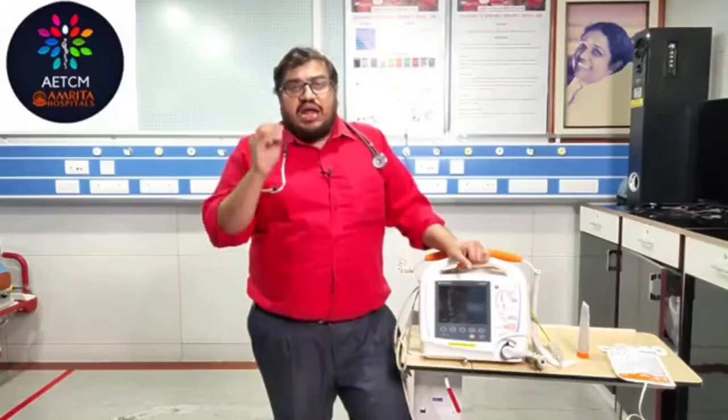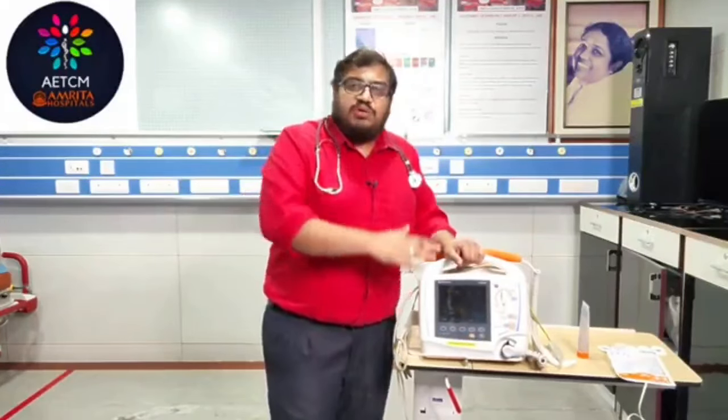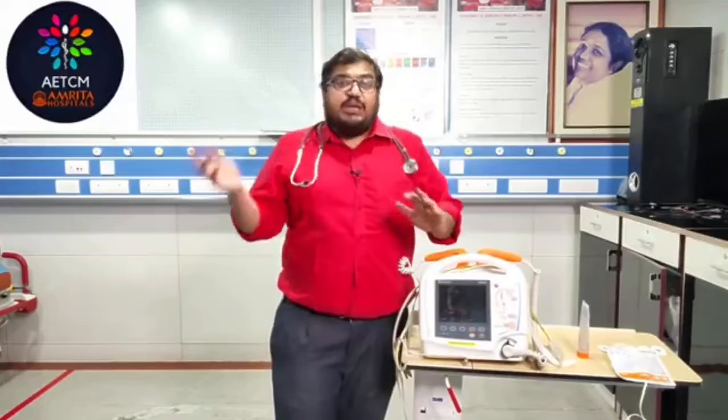As I told, consent, explaining the procedure to the patient, and procedural sedation are mandatory. And here, in cardioversion, we are selecting the smallest possible energy to start with. You know there are different types of arrhythmia: supraventricular tachycardia, atrial fibrillation, multifocal atrial tachycardia, and ventricular tachycardia where the patient can have a pulse.